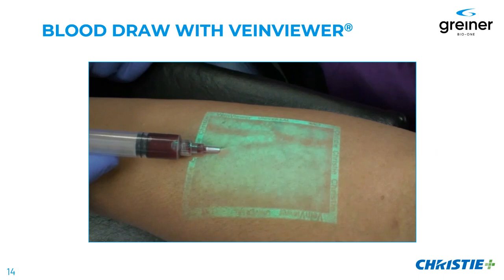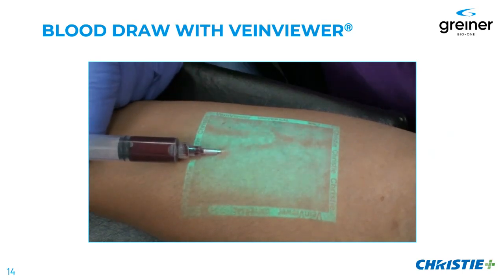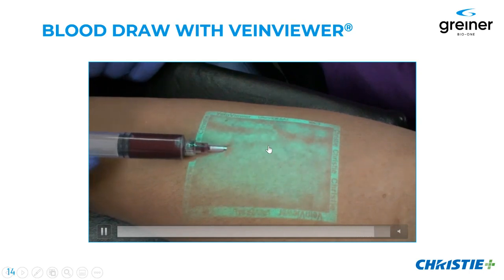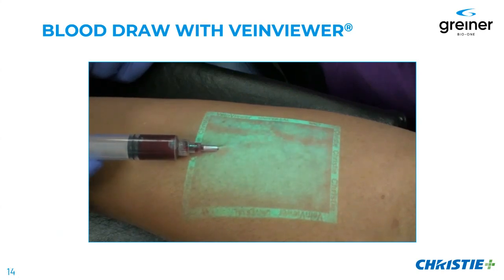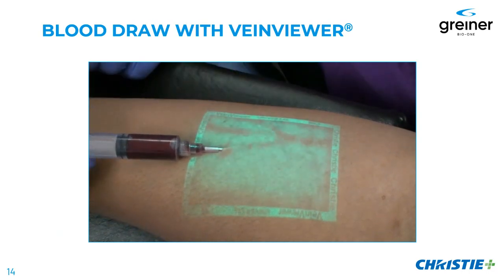This is a quick little snippet of what you can expect if you do a blood draw with VeinViewer and you are going to actually shine the light down. Now, obviously, this is a syringe technique, so this wouldn't necessarily be what you would see in a blood donation site, but I want you to pay attention to this segment of vein where the end of this catheter is lying. You can see as the vein refills with blood, it's a lot easier to see. As the clinician aspirates, the vein actually disappears. So this is another example of that real-time imaging where you can actually track what the vessel is doing and where the blood is going.